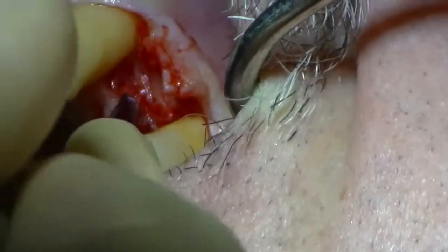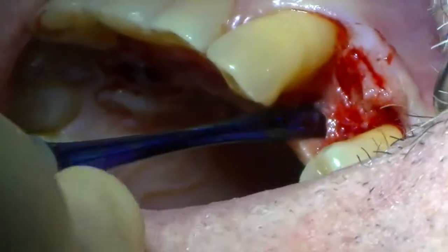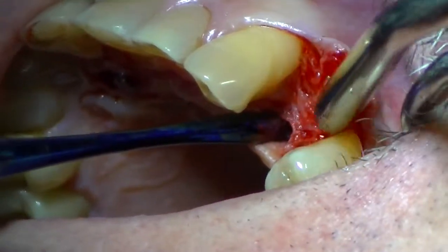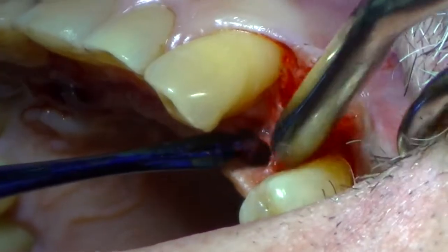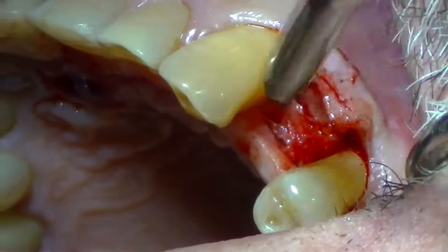the palatal area. Are we doing okay? So that I can see the entire crestal plate. This allows me to actually visualize the positioning of the implant.